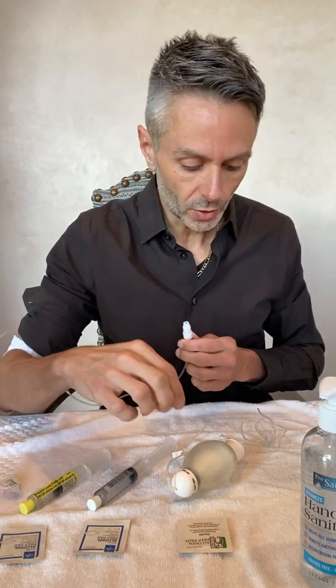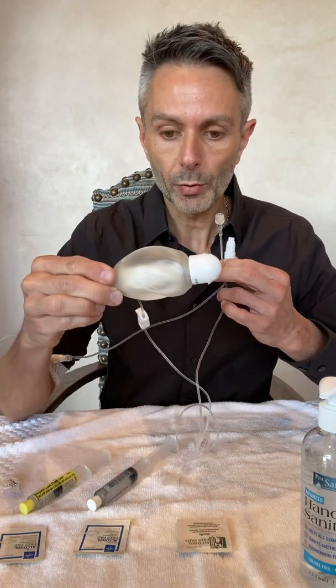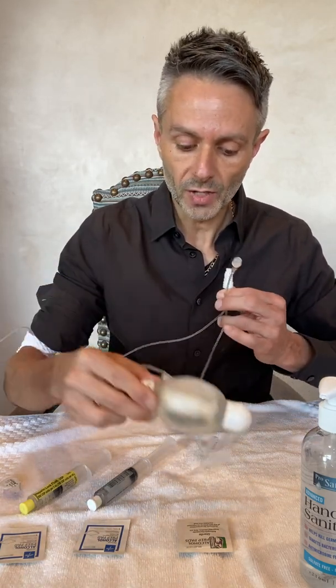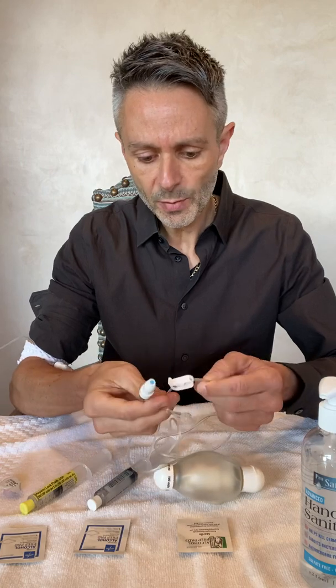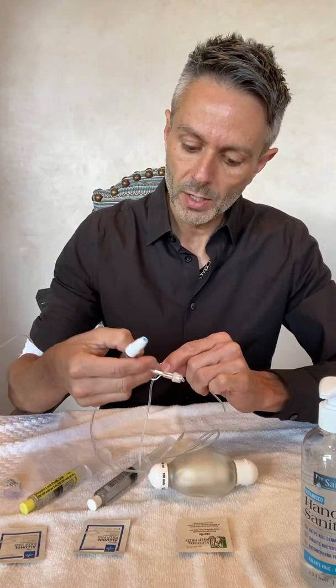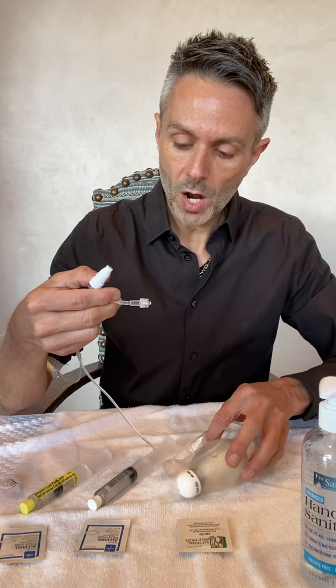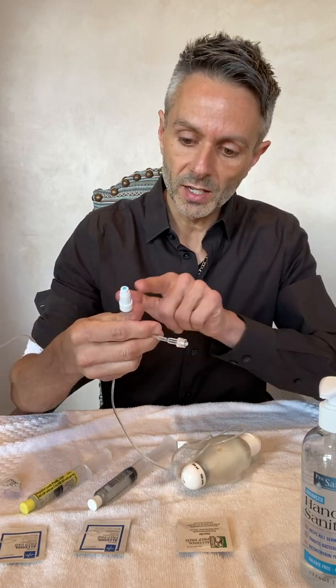Before connecting the tubing of my elastomeric pump, I want to prime the line because right now there's air in it and I don't want to push that air into my PICC line. To do that, take this clamp and pull it back to open it, then wait for the medication to drip out of the line. Once it's dripping out, clamp the line back so it stops. Now I know all the air has been pushed through and the line is ready to be connected to my PICC line.